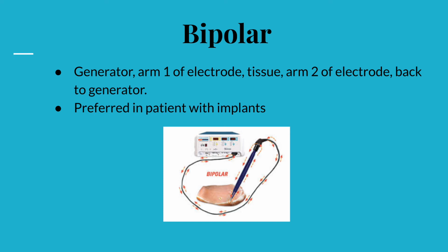The key difference in bipolar diathermy is the presence of two diathermy electrodes instead of one, and the absence of a diathermy plate. Hence, this is often the diathermy of choice in patients with implants.